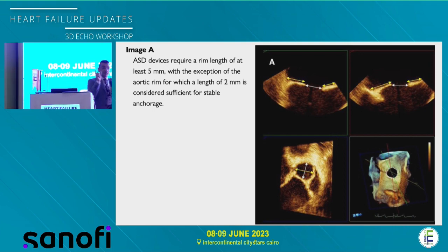As we have seen, measurements in millimeters are done only on axial images. And also this is an image from the most recent article about the use of 3D.